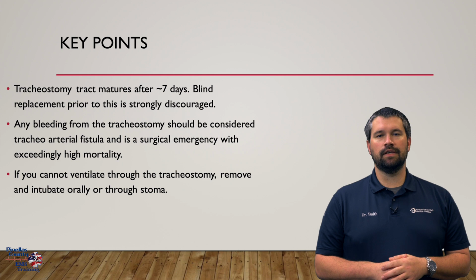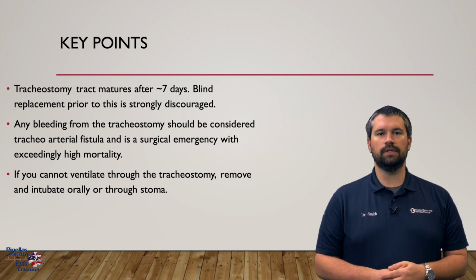If you cannot ventilate through the tracheostomy, remove it and intubate orally or through the stoma.